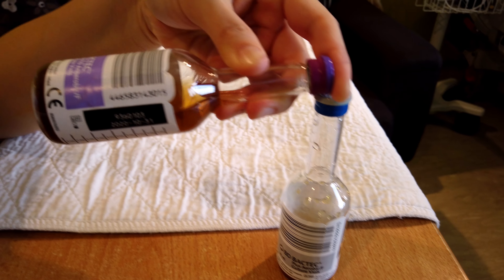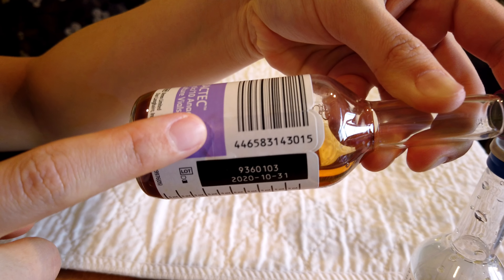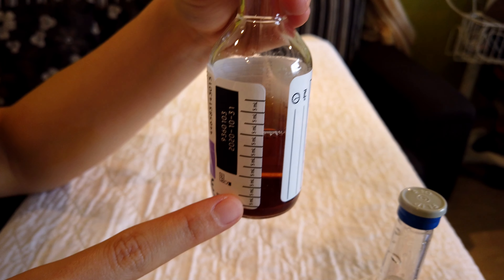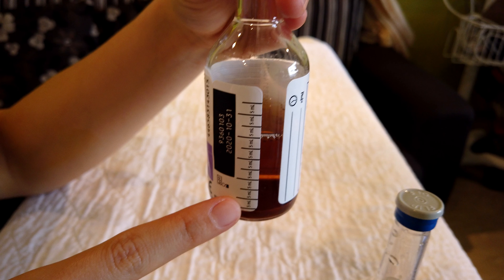Each blood culture bottle has a unique barcode. You should also check the expiry date stated on the blood culture bottles. There is a milliliter scale on the side of the bottles to help you gauge the blood volume needed.